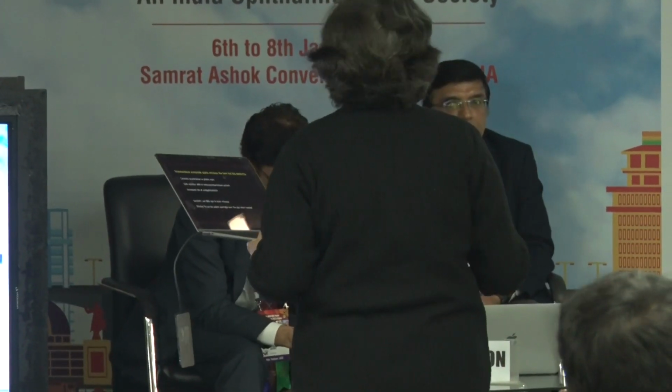So we're going to retina and retinal surgery, core retinal surgery in diabetic vitrectomy. And we're just thinking of the tips to identify. So there's 7 small points I'd like to put. One is that you have to know the pathology of the membrane. There is always a second membrane. That's a key point you have to notice, and you always have to look for it.